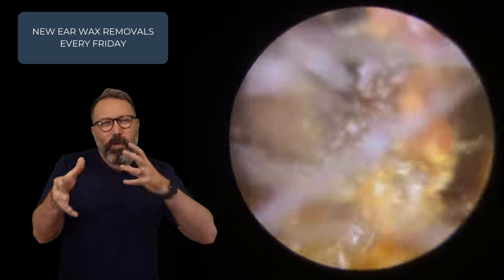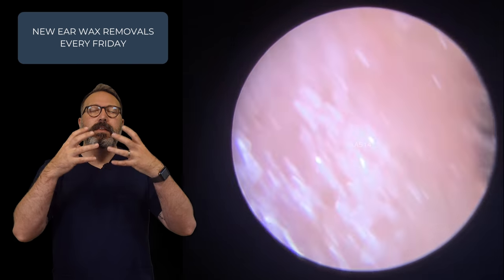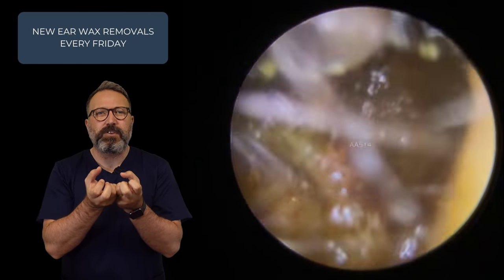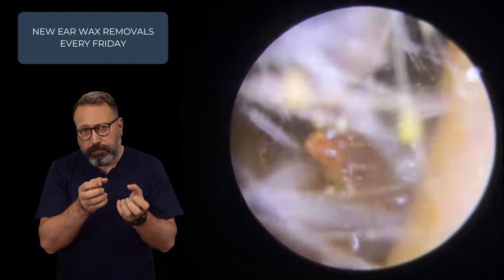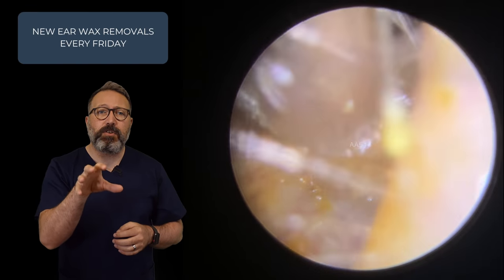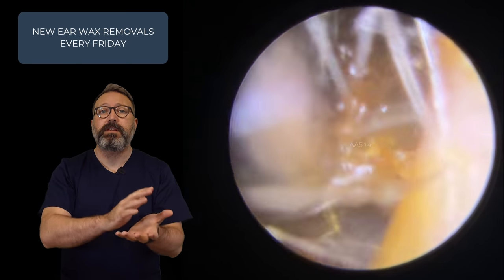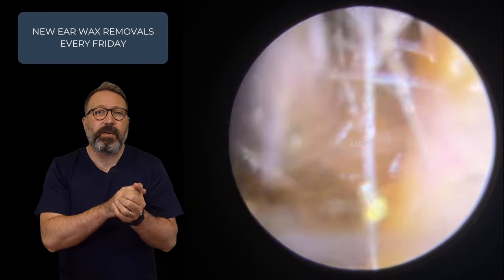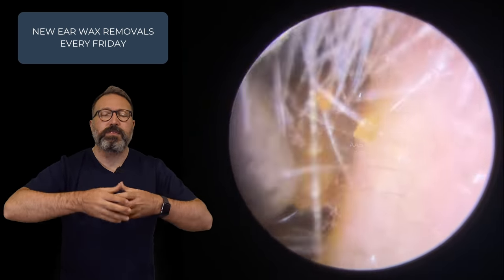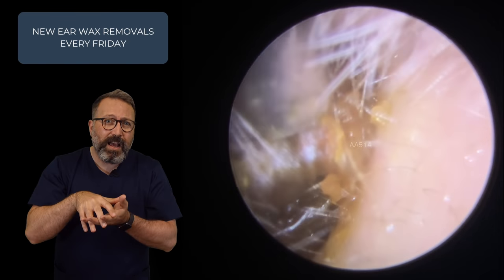We've got a really good grip on there, wiggling back and forth, but it really just did not want to budge. As we pull this down, you can see this wax is a slightly different consistency — it's sticky, but it's more this fudgy type of consistency, which is never an easy one to remove with suction because it tends to break away in small chunks and block the end of the suction tube. So I've popped some olive oil in here — a little bit of olive oil into the ear canal that coats the surface of the wax, which makes it slide across the skin a little bit easier, and also helps me get a much better suction grip. Sometimes it will soften it as well.